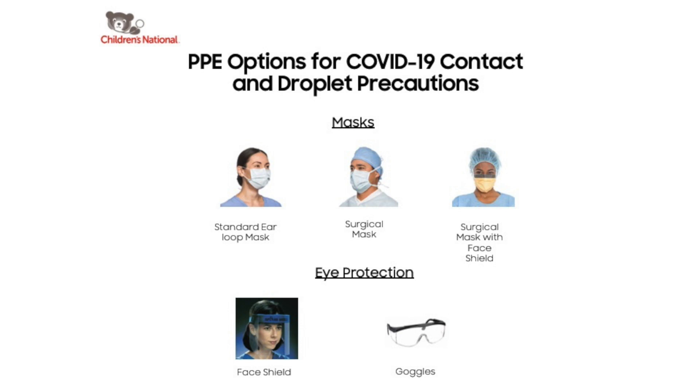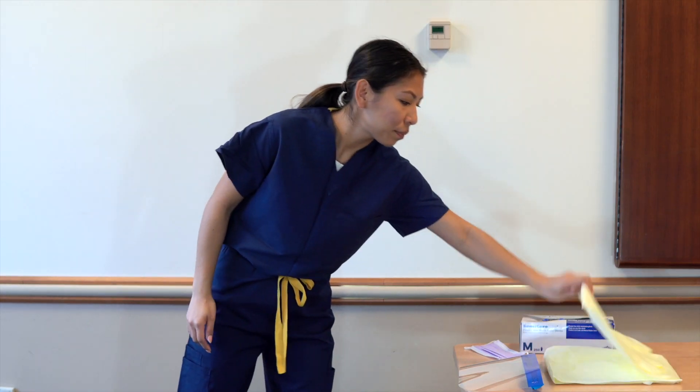A COVID-19 patient under investigation, or PUI, should be placed on contact and droplet precautions with eye protection. First, don gown.